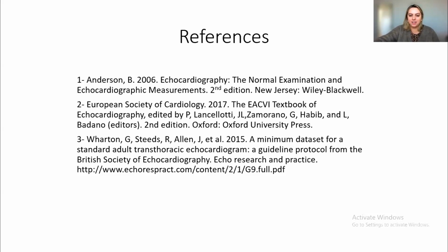And Dr. Imam, what is the correct answer here? Very nice, very nice. Yes, parasternal long axis view. This is the classic left parasternal long axis view, not apical. Maybe we can confuse it with the subcostal view, but not with the apical. In the apical view, you can see the apex, right? This is exactly the parasternal long axis view.